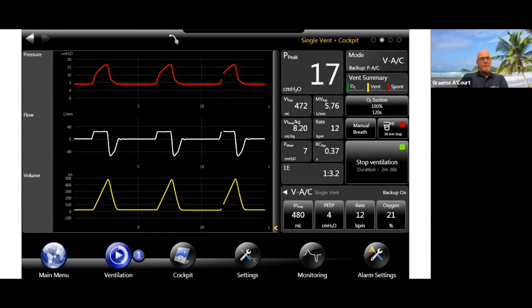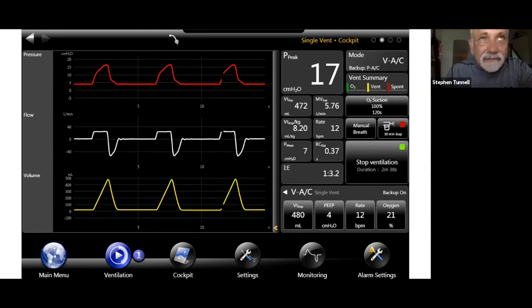That's right. There was an article, and I've referenced this before, on Ventilation Matters. I'll have to find it, and maybe we can talk about it. Out of 20 ventilators that were studied during the pandemic, a significant amount of them, like 75%, didn't actually do what they said. The good news is most of those ventilators are not ones any of us are going to use anyway, and the good high quality ICU ventilators did tend to do that.